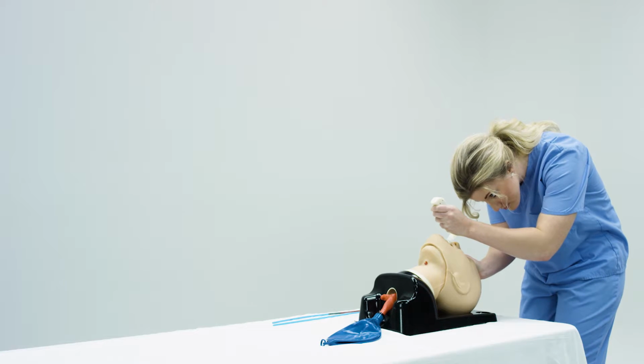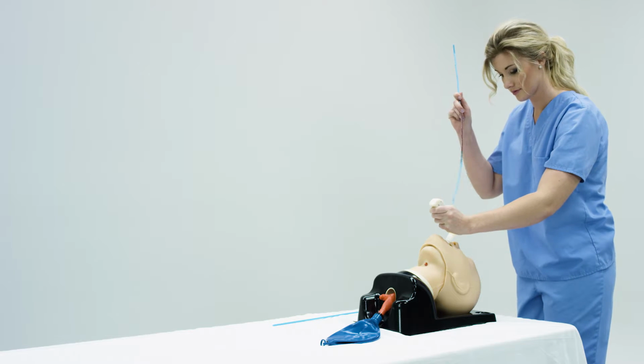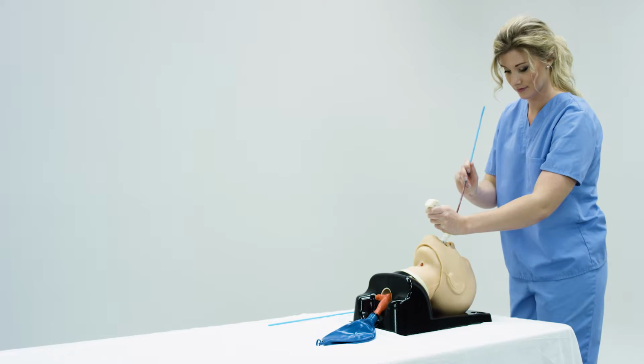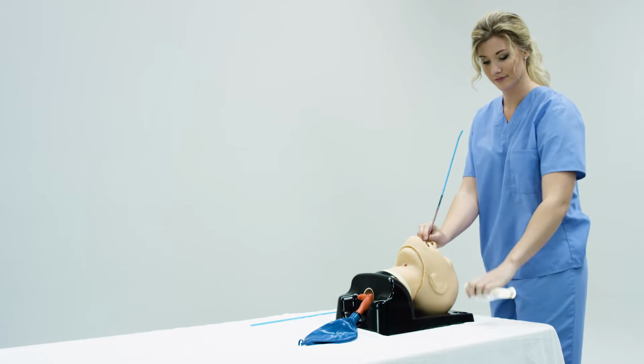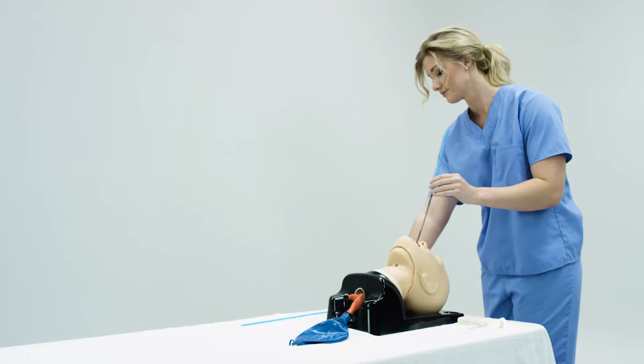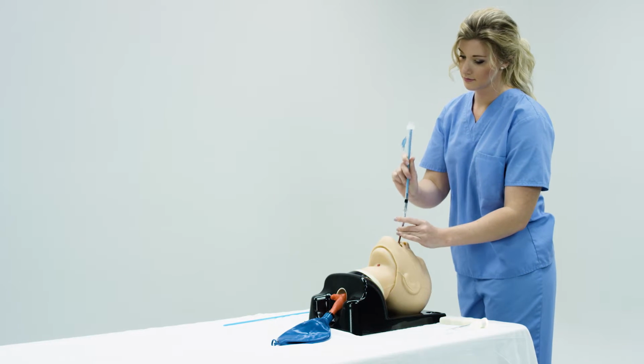To begin, insert the scope and identify the glottis opening between the vocal cords. Next, pass the bougie under direct vision between the vocal cords and into the trachea. The scope is then removed, leaving the bougie in place. The colored markings on the bougie help the user keep the bougie in the correct position.